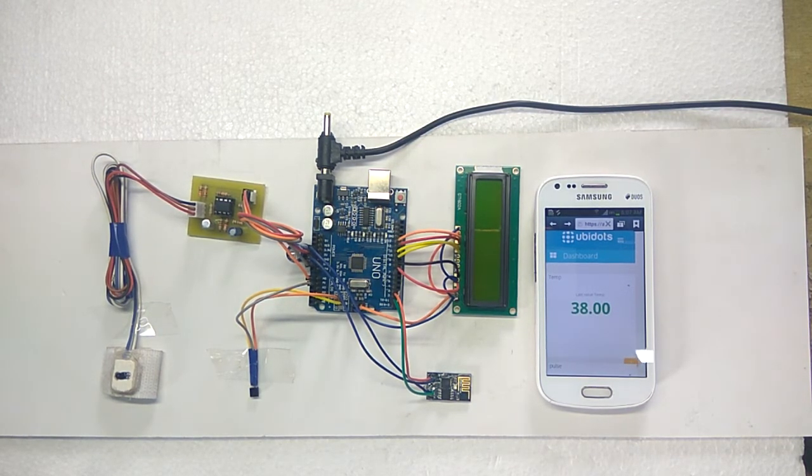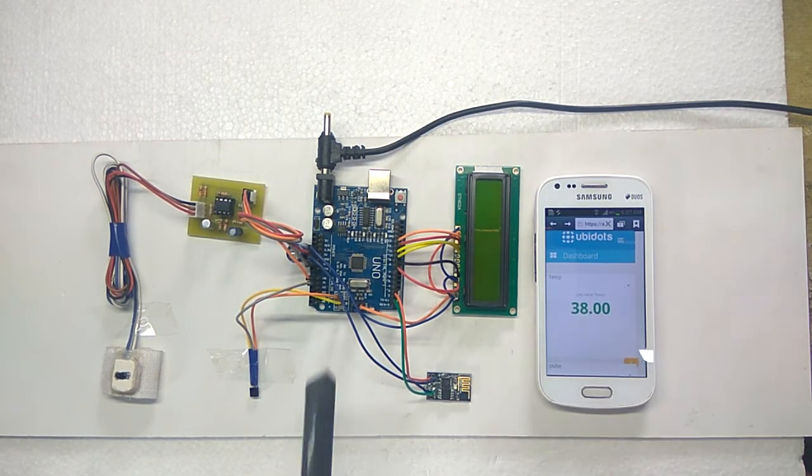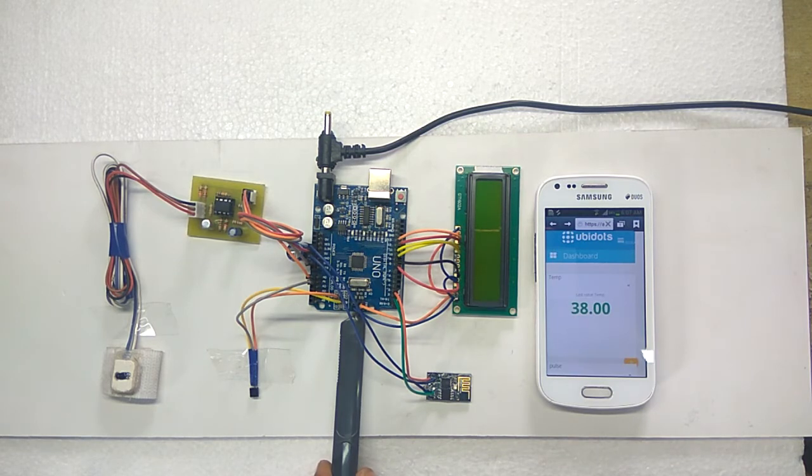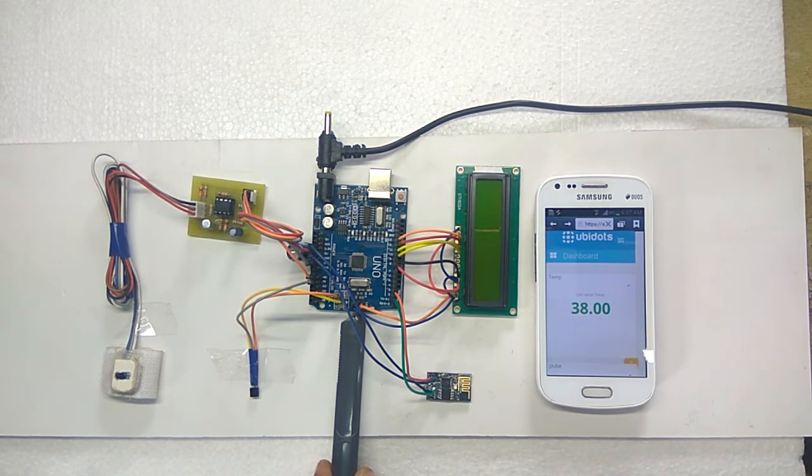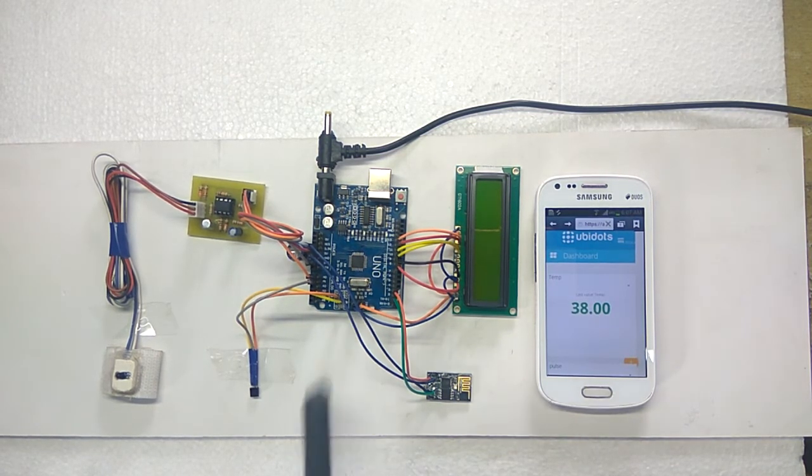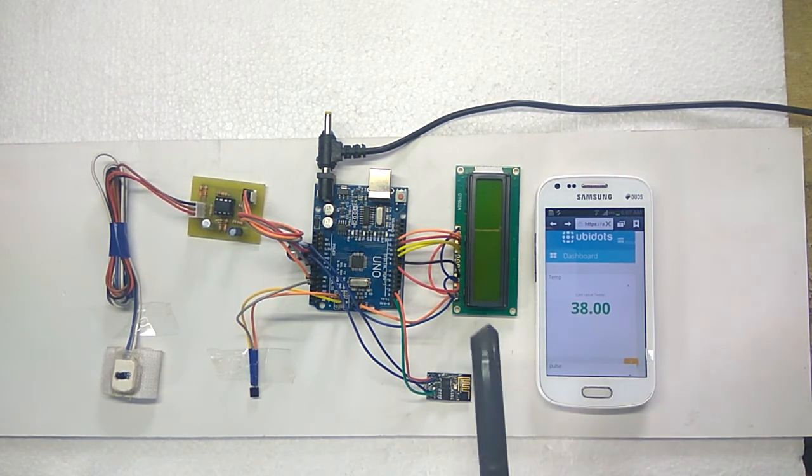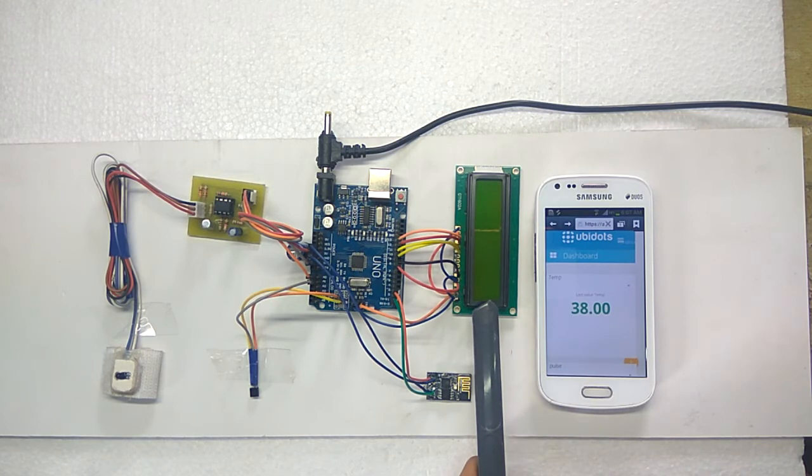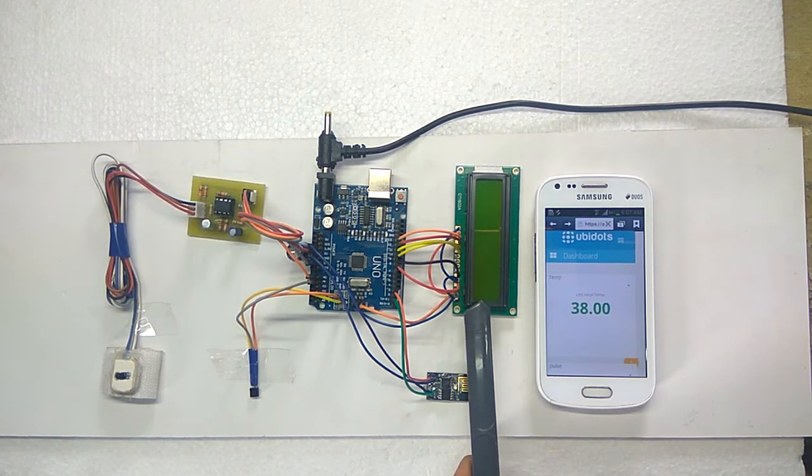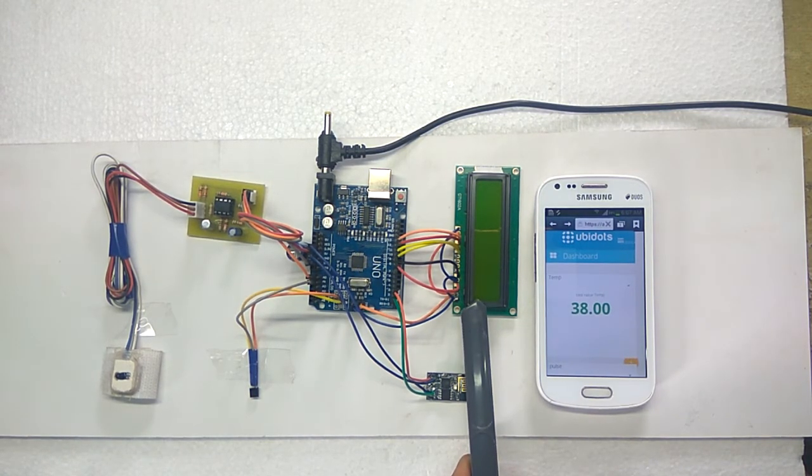The circuit consists of Arduino UNO board. It consists of IC ATmega 328p. 16x2 LCD display. It shows the heart rate and body temperature.